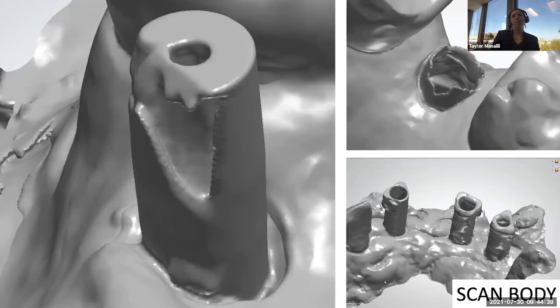And the bottom images here, unfortunately, it's a much better scan than the other two, right? But we still have some distortion. And so we really need to make sure that that scan portion is as clear as it can be, okay, for the lab to accurately align their library with your scan body.